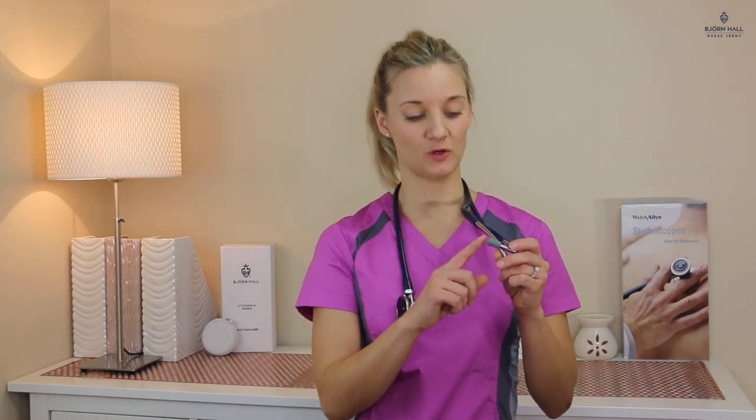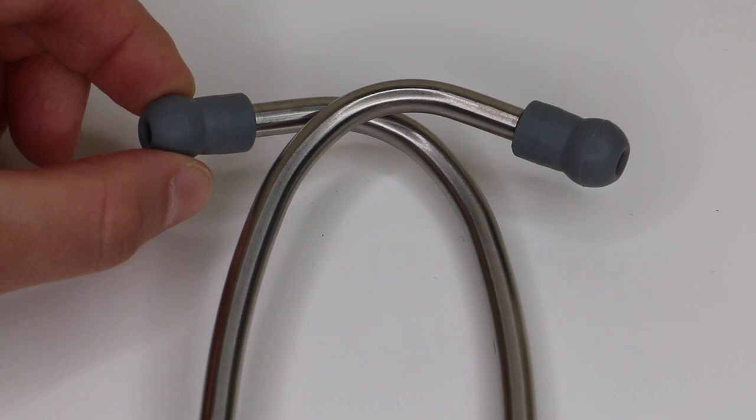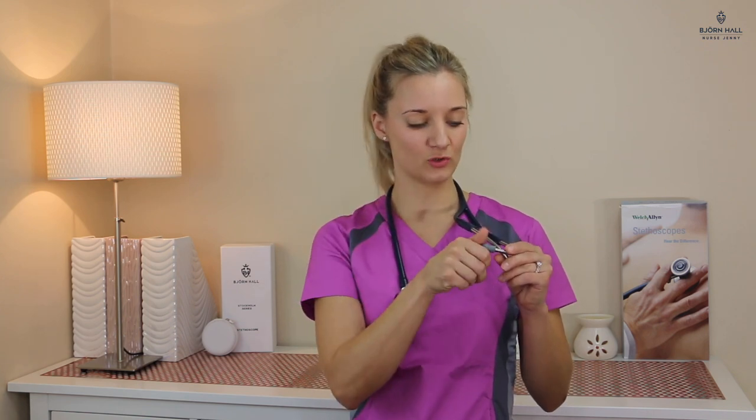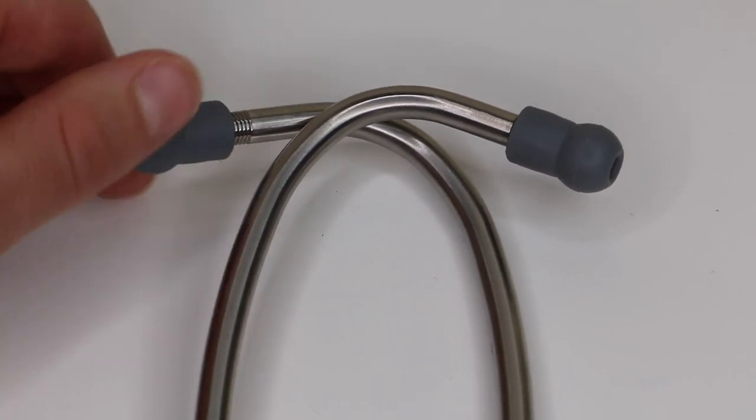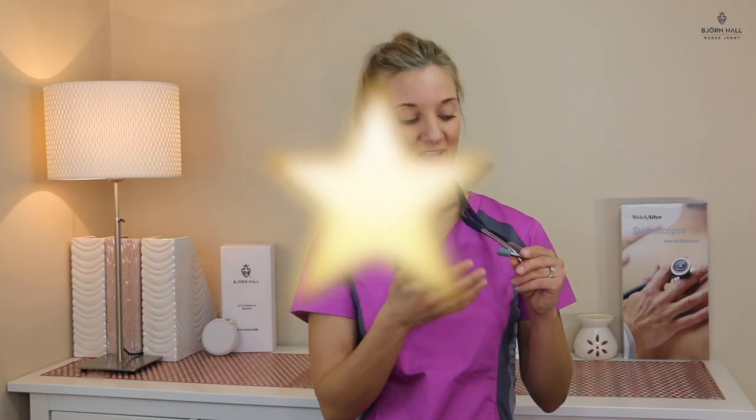Eartip comfort. Welch Allen market these ear tips as soft sealing ear tips. To me, they are not as soft as they could be and they're quite small and hurt my ears. I prefer them to be a little bit bigger to create a better seal. They're also a screw on and off, and I don't like that feature because they do screw off at work and you lose them. So I have given it a one out of five.